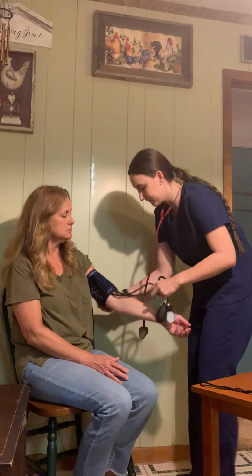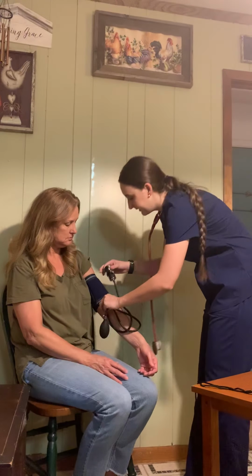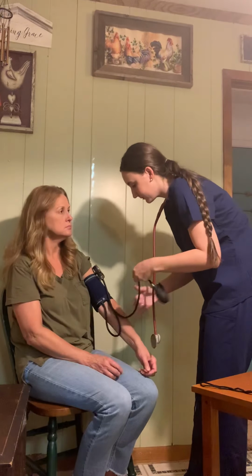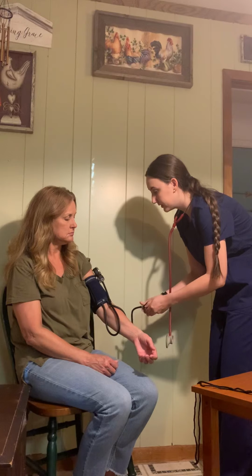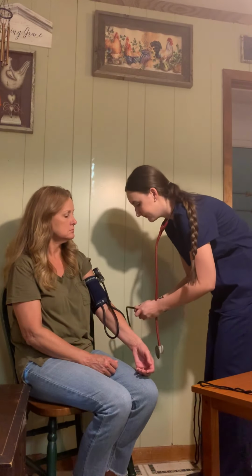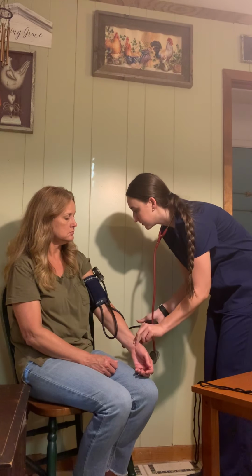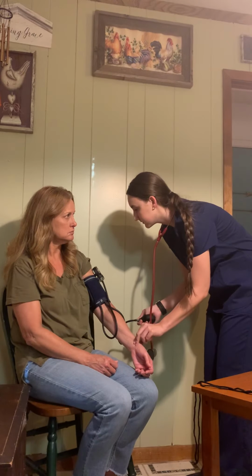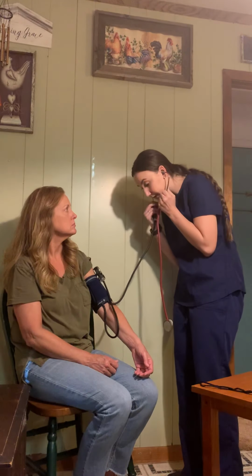Is that comfortable there? Mm-hmm. I'm going to place this dial here so I can read. Okay, so you relax your arm. First I'm going to measure your radial pulse, so you just relax on this one. Okay, so now I am going to measure your blood pressure. Let me put my stethoscope on so I can hear your heartbeat.